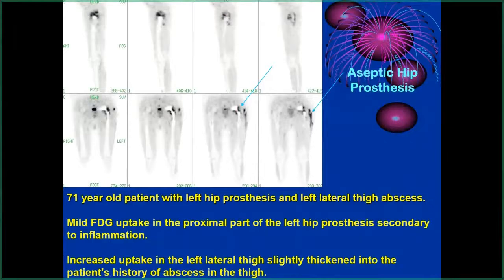This is, of course, a patient who also was suspected of prosthesis infection, but FDG clearly shows in this particular patient findings suggestive of subcutaneous inflammation and not infection in the body of the prosthesis. So patients like this could be managed non-invasively without revision surgery, and this really has become a major contribution of FDG-PET in assessing patients with prosthesis.